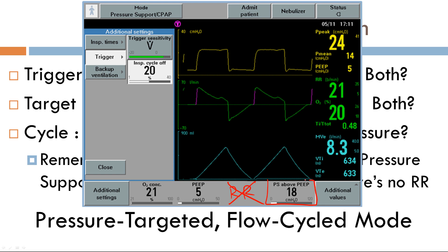Looking at the waveform: there is no respiratory rate set at all. The target variable is the pressure support above PEEP. The cycle variable is set at 20% of the peak inspiratory flow, and the baseline phase is PEEP of 5.